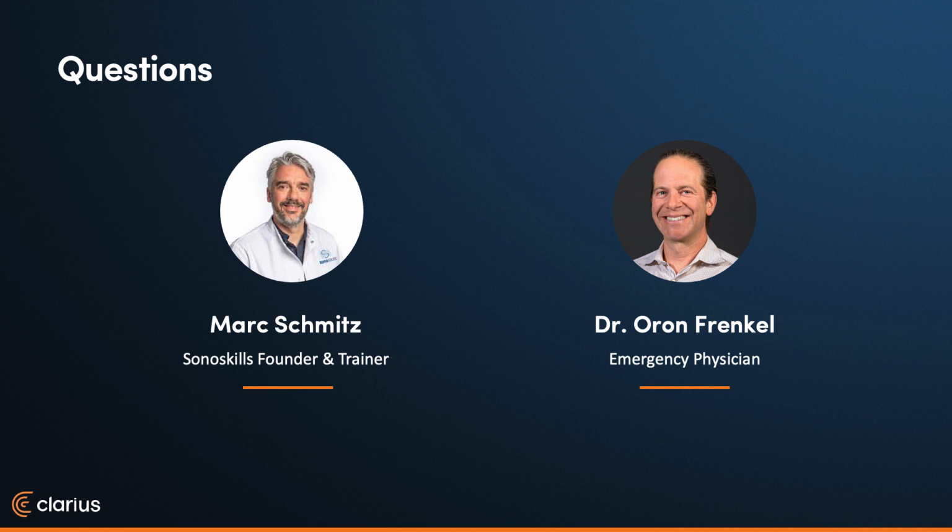One thing a lot of people want to know is, can you assess the labrum, like a SLAP lesion, or how reliable is ultrasound for that? Yeah, so the labrum is really well to see in the anterior approach, inferior approach, and posterior approach. I would not say that ultrasound is the golden technique to score the labrum. So let's be honest about that. I think that other medical imaging techniques are a little bit better about that.